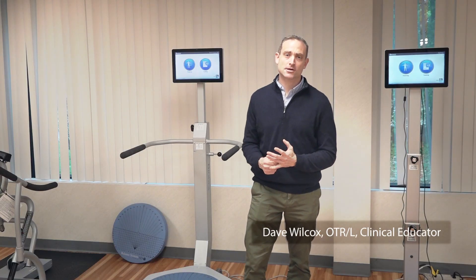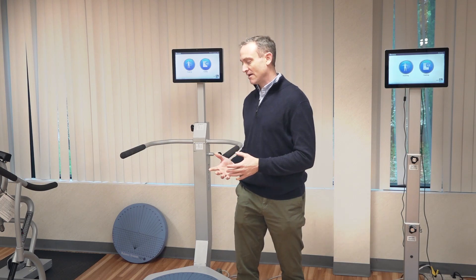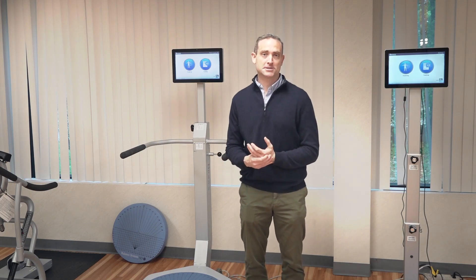Hi, my name is Dave. Today I'd like to talk about training on the balance system after a person has a total hip replacement.